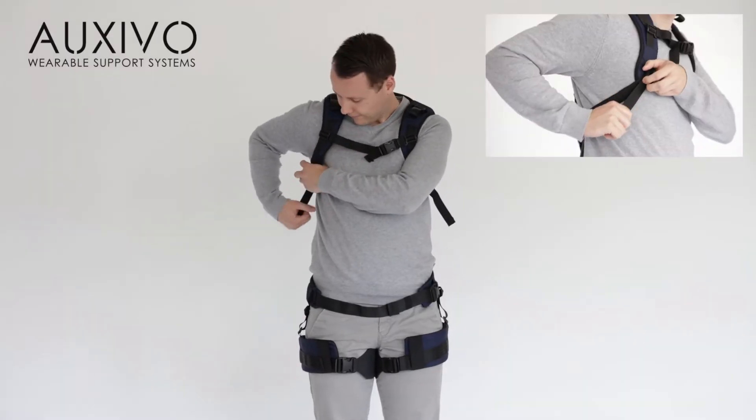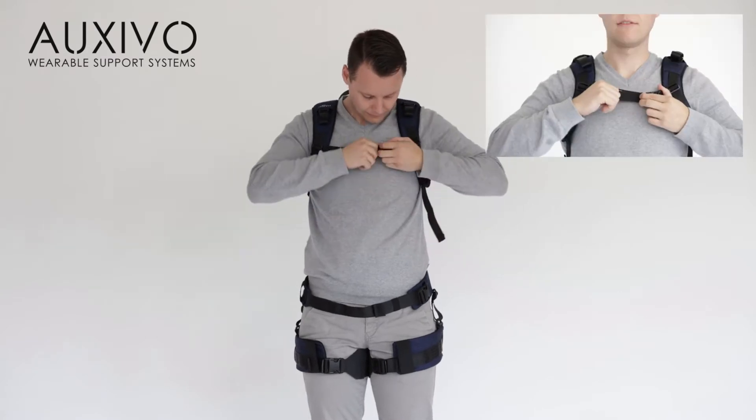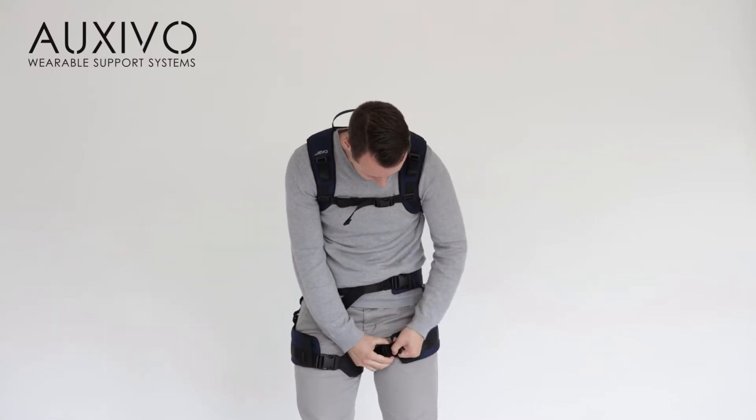When you use the lift suit for the first time, it needs to be adjusted to your body size by tightening it on your torso, hip and legs. Be sure to tighten it enough that it does not slip but remains comfortable to wear.